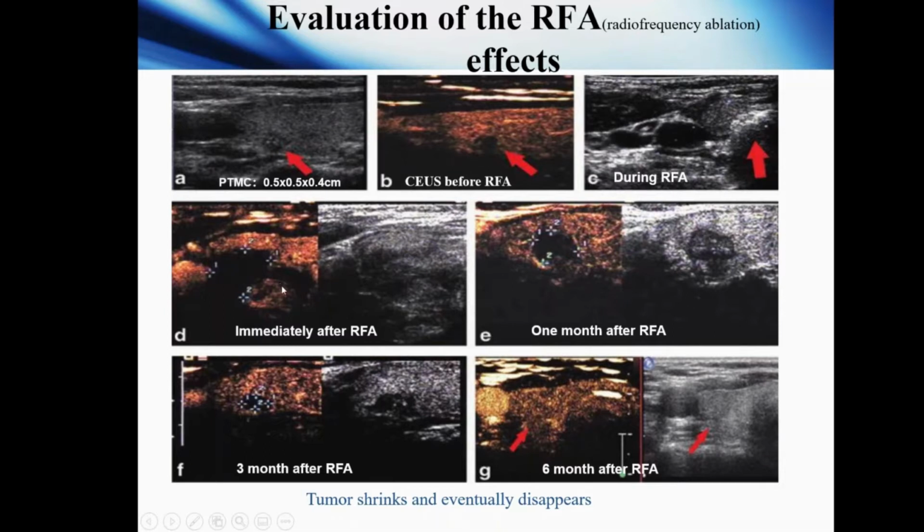During the follow-up, we can see the ablation zone was smaller and smaller until it finally disappeared. So CEUS is good for diagnosis of the nodule.